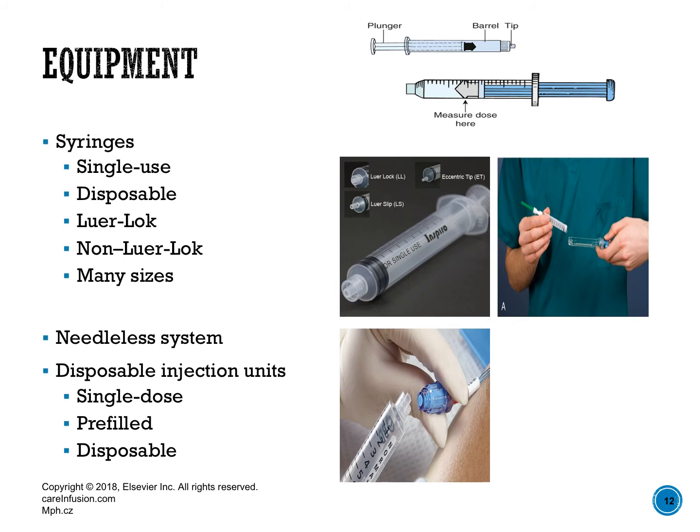Since you will be using syringes to draw up your medication, it's important to review syringes. Remember, there are different types of syringes. They're disposable, and they can be luer lock, which twist on, or a non-luer lock, or luer slip syringe, that will actually just push on. Most of what you will use for an IV push is going to be a luer lock.